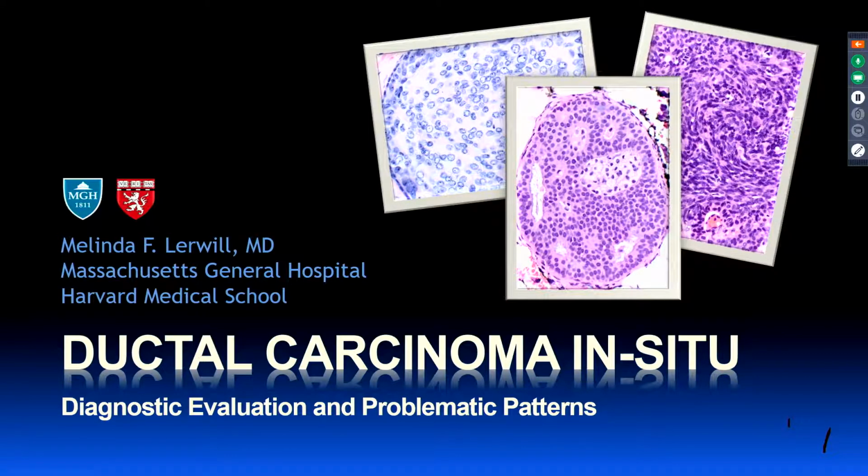So I'm going to talk about a point of tension in breast pathology, which is a very common everyday problem that we all face if you look at any sort of breast specimen, and that is evaluating intraductal proliferations to determine whether they are benign or whether they are neoplastic. And this can be quite tricky at the low-grade end of the scale, as you know, because what constitutes cytological atypia at the low-grade end of the scale in the breast is really somewhat subtle. It's often not an overt atypia, although there are very useful cytological and architectural criteria that you can apply and will help you consistently to evaluate these.